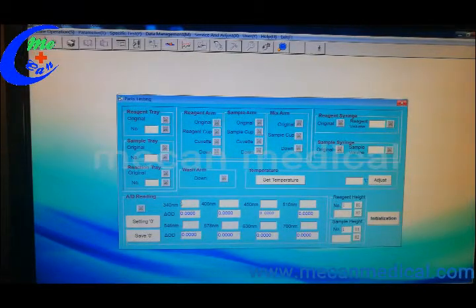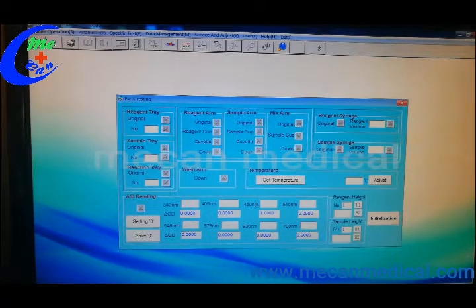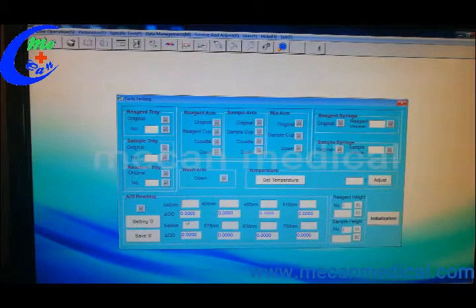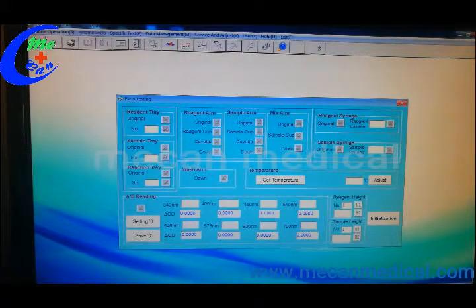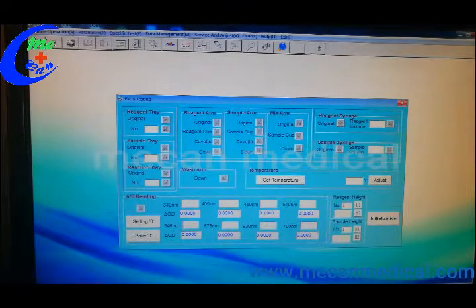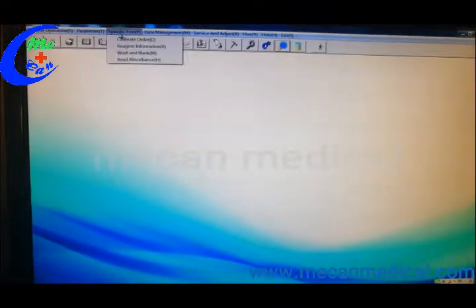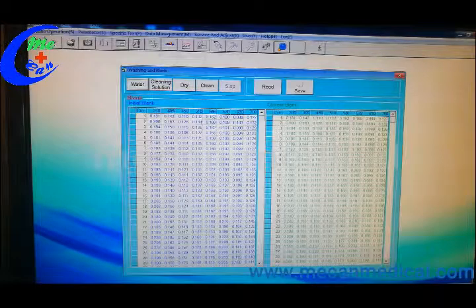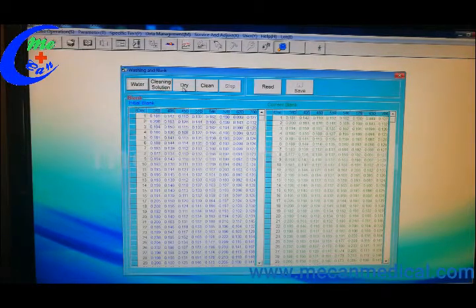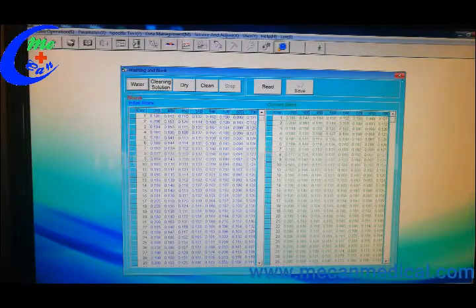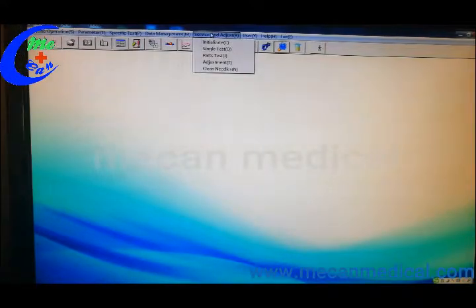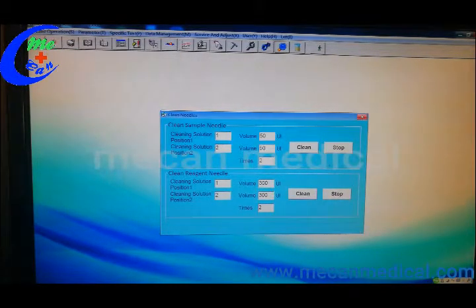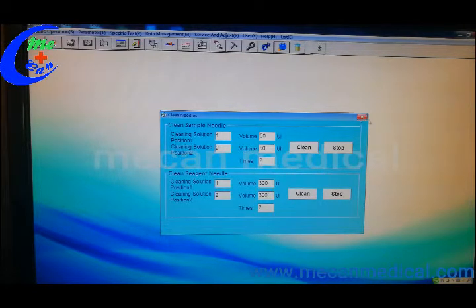All these values, and this one is washing and blank. You can do water cleaning solution, dry clean from here, and also there is a clean needle function. You can use this to clean the needle.